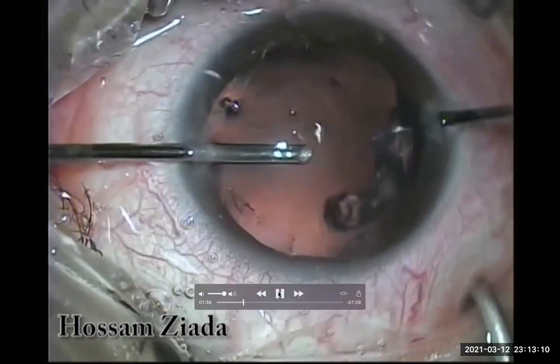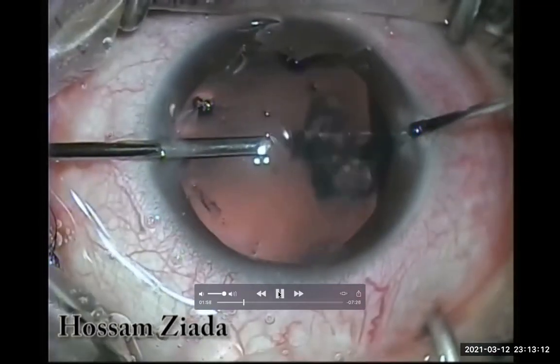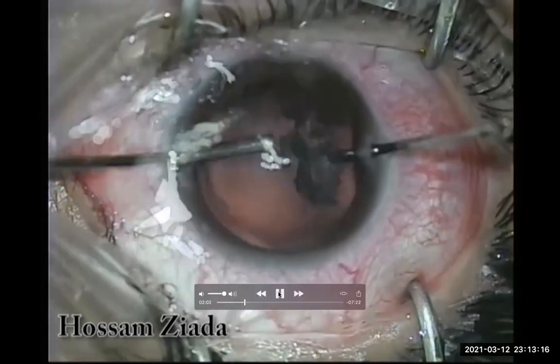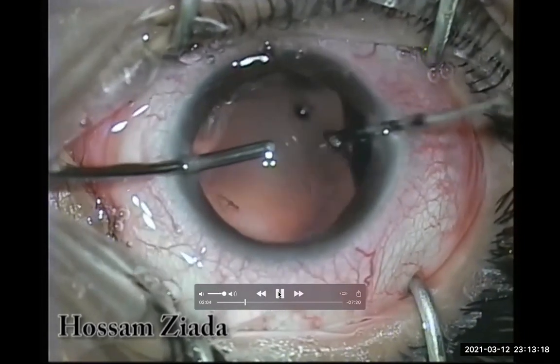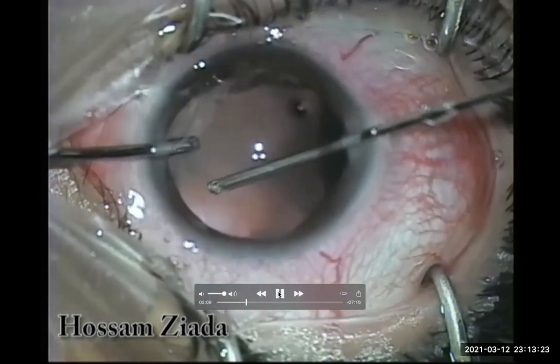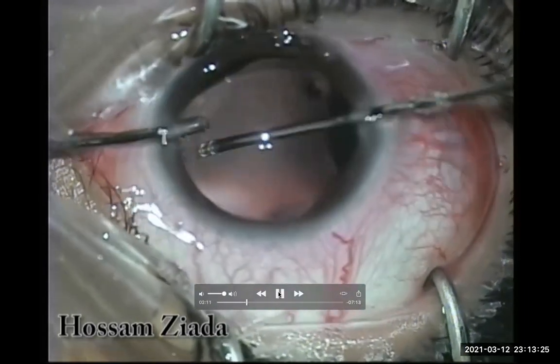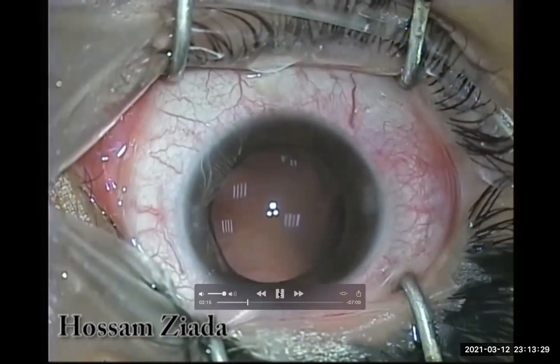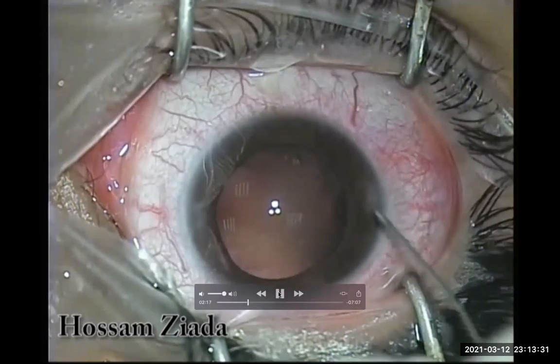Most of the lens was removed with the ocutome, and this is the last piece — I'm carefully dealing with it now. It's clear now: there is no bag, there is no lens. It's open sky.